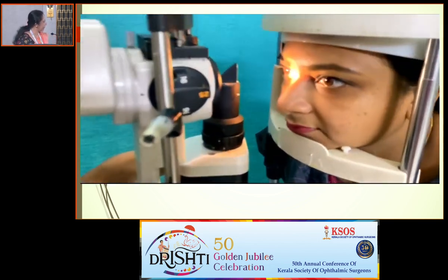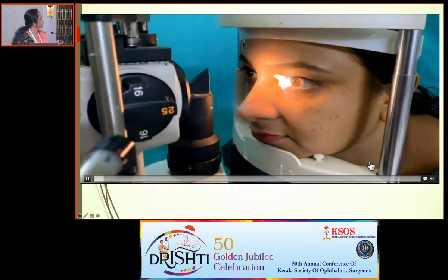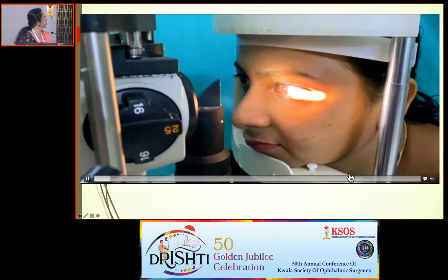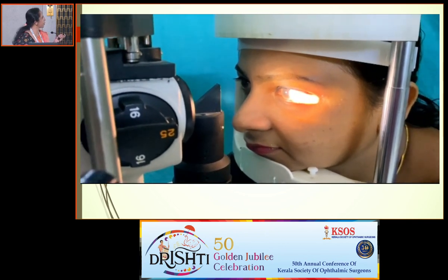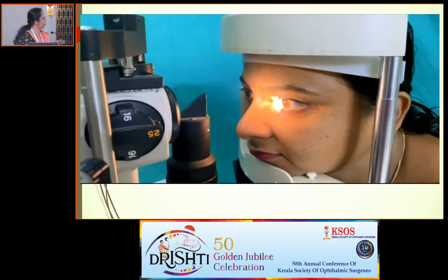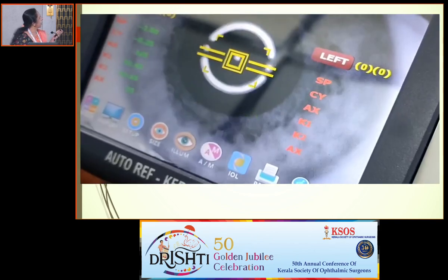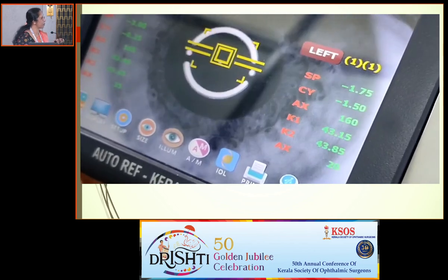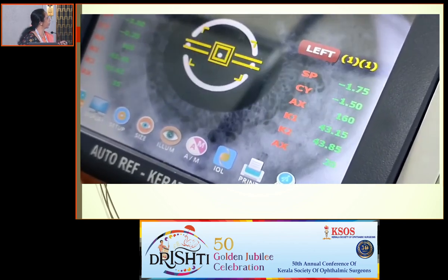On the slit lamp, the patient has to be scanned throughout for any abnormalities which may hinder contact lens use. You have to scan from the temporal to the medial side, and check whether there is any evidence of lid abnormalities, and the conjunctiva. Then a subjective and objective refraction has to be done for the patient.